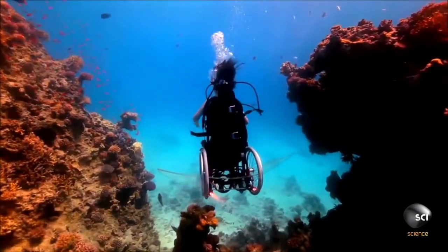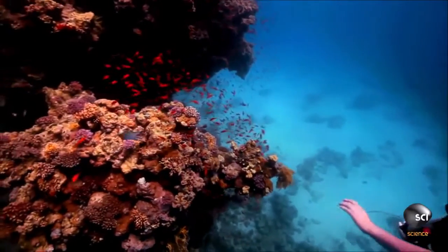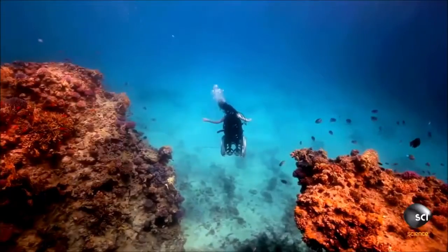It started as a visual artwork that was about placing the wheelchair in the most unexpected environment I could think about. I started talking to engineers and they were so convinced it wouldn't work. It really nearly put me off.